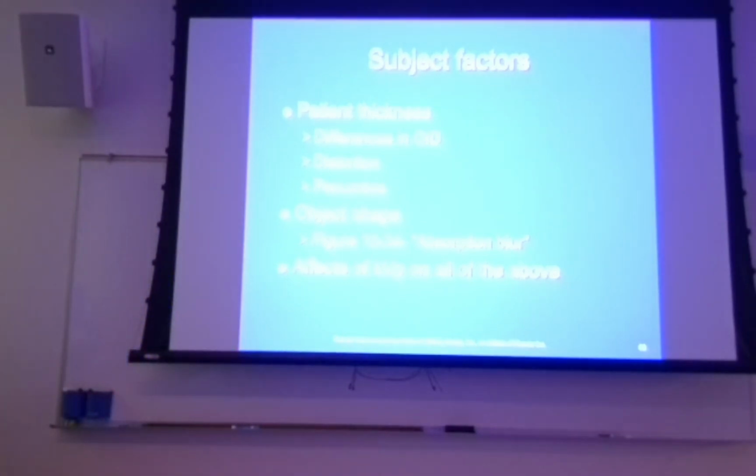So you're going to have natural distortion with patients who are thicker. You're also going to have a loss of sharpness of recorded detail and increase in penumbra as well. And then we've kind of done object shape to death, so we're not going to talk about that.